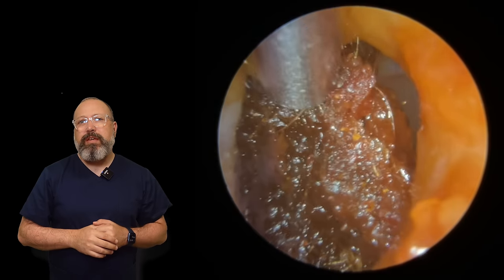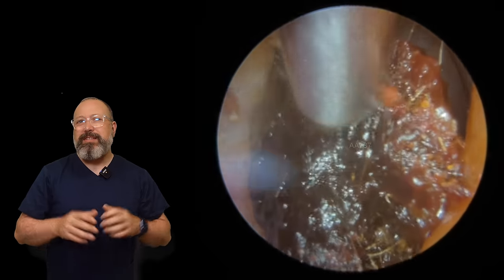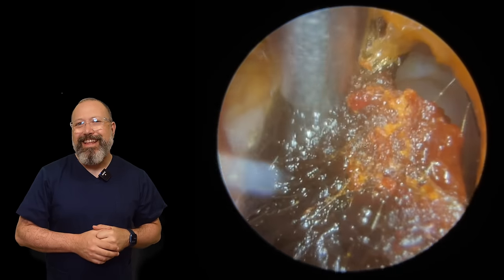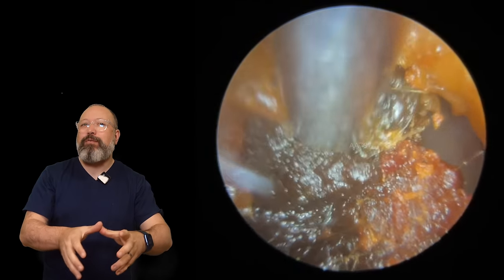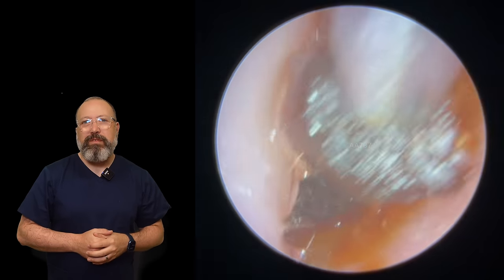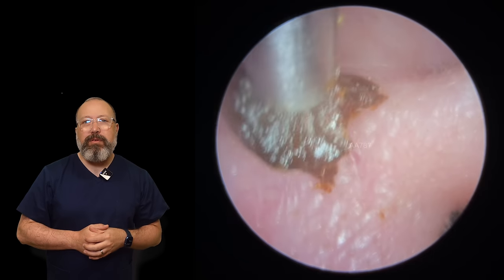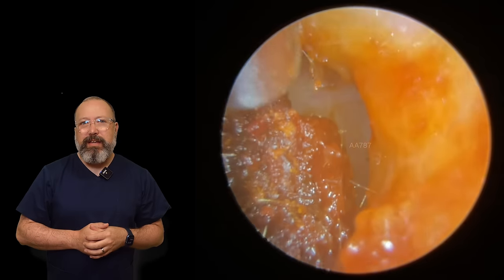Every time we take a bit you can see the suction tube just inching forward ever so slowly. There's just a little bit more movement to it now, a little rocking motion going on. There you go — you saw that pull forward, a little detachment, and now the whole thing is coming toward us. The olive oil is going to help stop it adhering to the canal walls again. It's coming away very nicely.